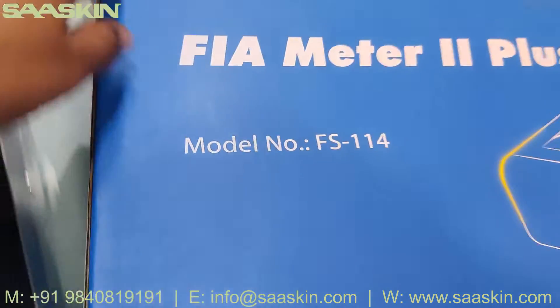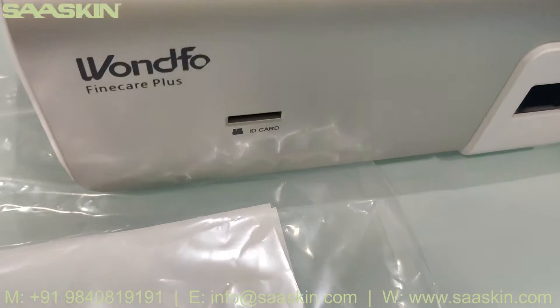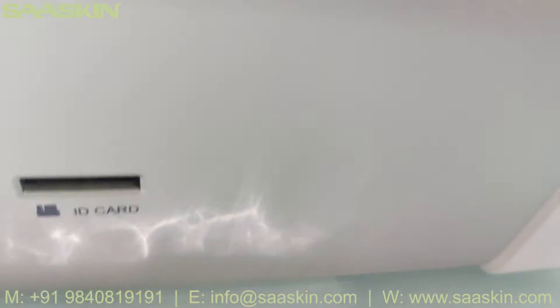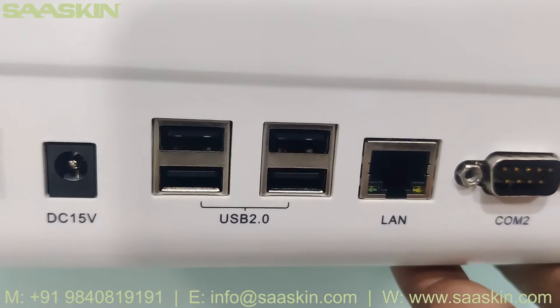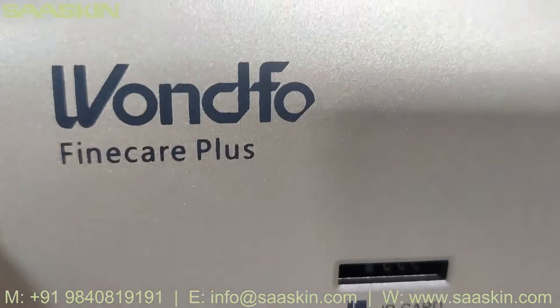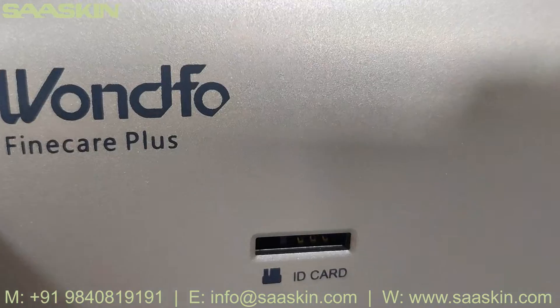We have just taken all the items out from the FineCare FIA Meter main box. You can see the machine is available here. This is Unfo FineCare and there's a position where you put the ID card. On the other side you can see provisions for the power cord, USB, LAN and all other provisions. It says Unfo FineCare Plus, and the model number is FS114.